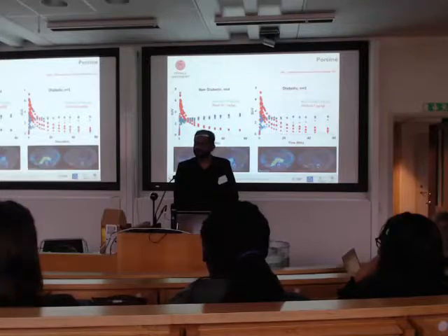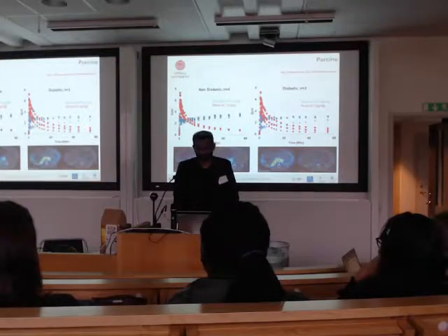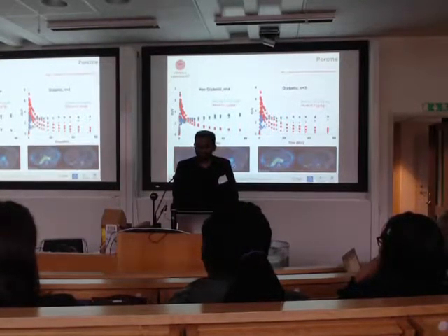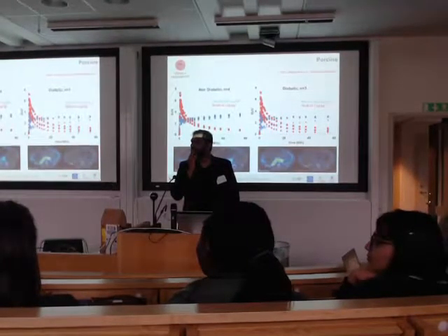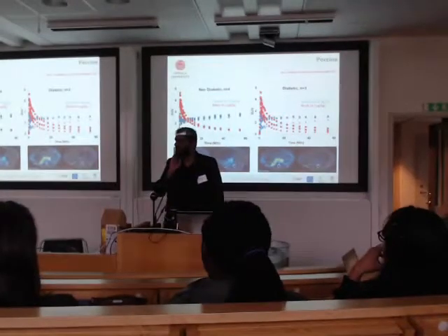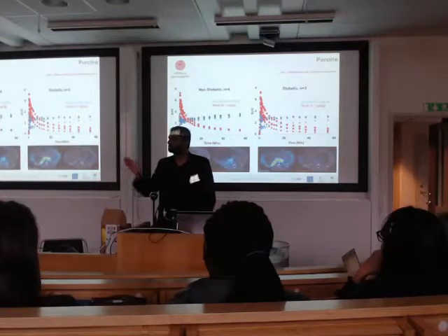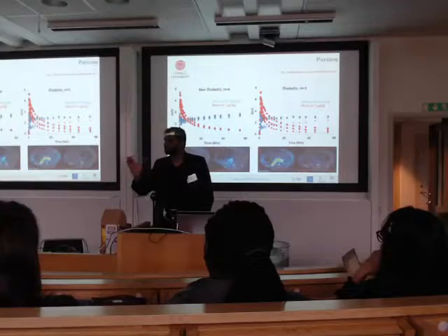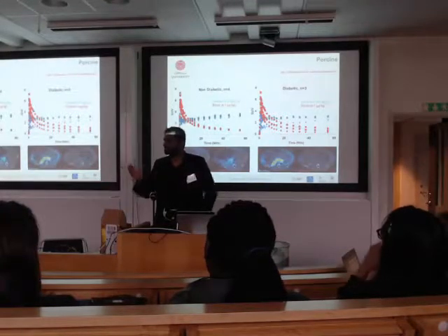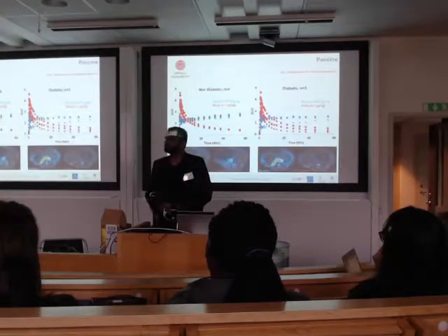Any difference? This was one of the disappointing days in my life. I mean, yeah, life is tough. There is tracer, yes. But as I said, diabetic animals do not have insulin-secreting beta cells. If the tracer is supposed to bind to the islet cells, we shouldn't see any uptake in the pancreas, but we see it.